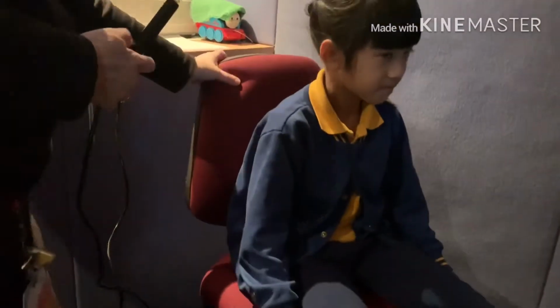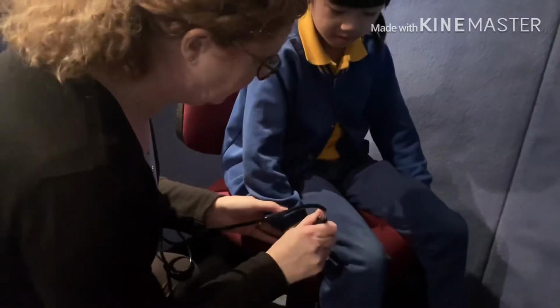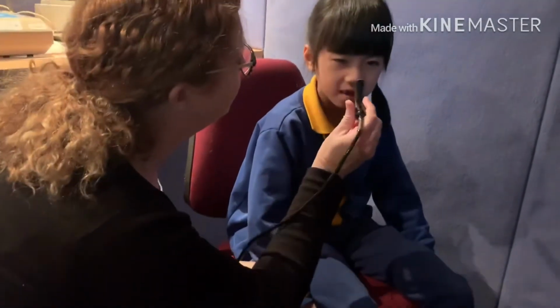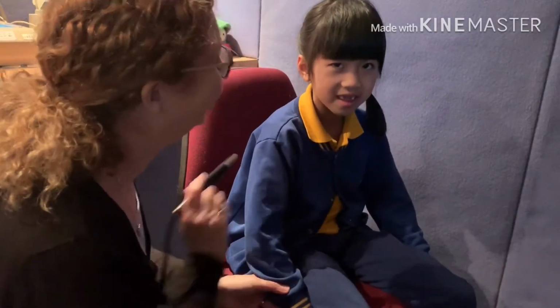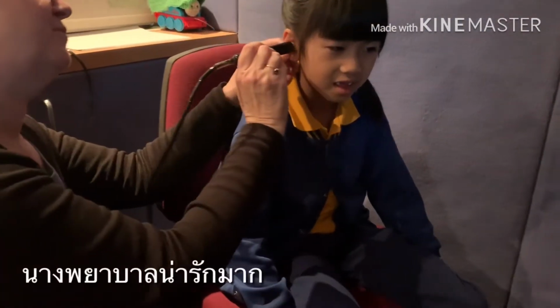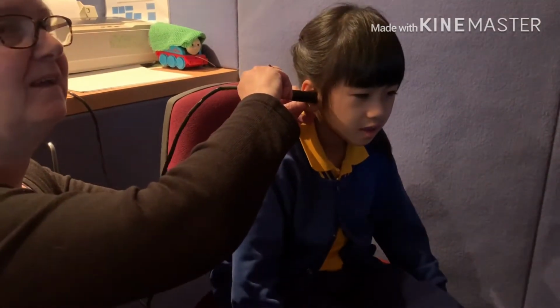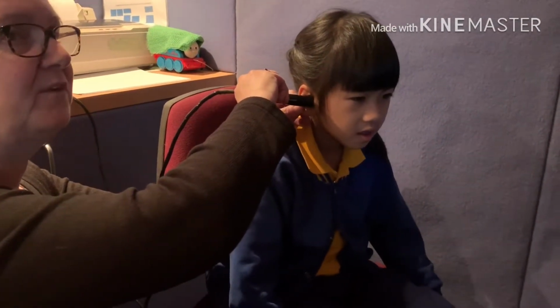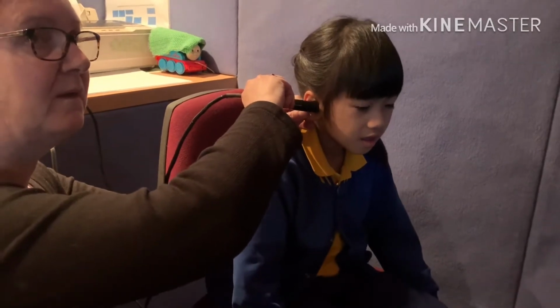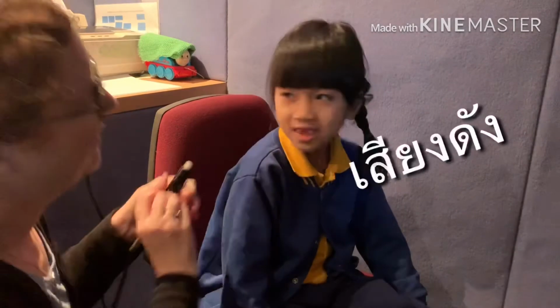Okay. All right. And I'll just show you how it feels on your hand. How about your nose? Or your cheek? Yeah, so we just put it on your ear and it will test the pressure in your ear here. And you'll hear a beep beep. Sorry, it is a bit loud. I had the other ones quieter, didn't I?